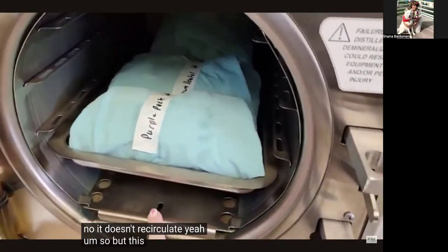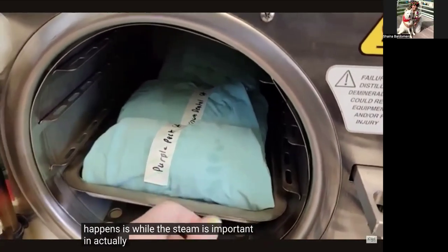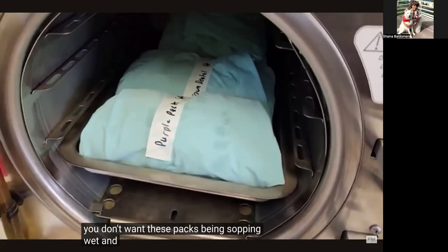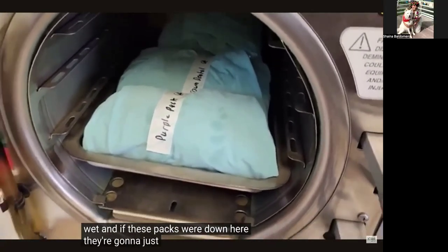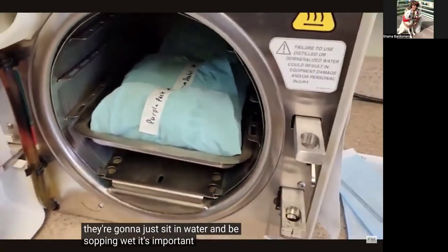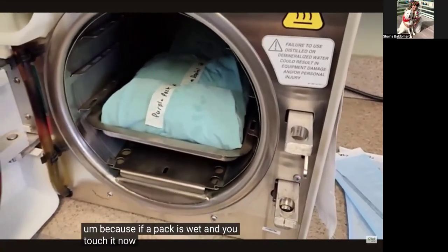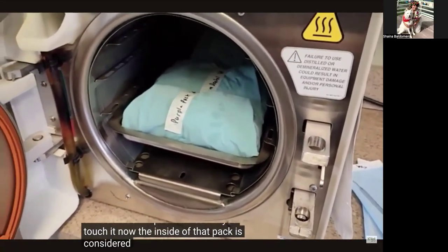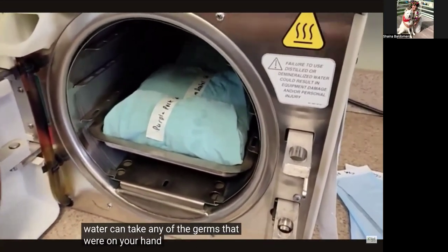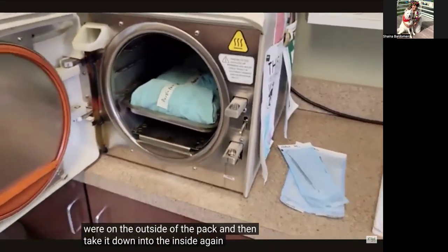So, this is important because while the steam is important in actually sterilizing the instruments, you don't want these packs being sopping wet. And if these packs were down here, they're going to just sit in water and be sopping wet. It's important because if a pack is wet and you touch it, now the inside of that pack is considered not sterile, because that water can take any of the germs that were on your hand, any of the germs that were on the outside of the pack, and then take it down into the inside again.